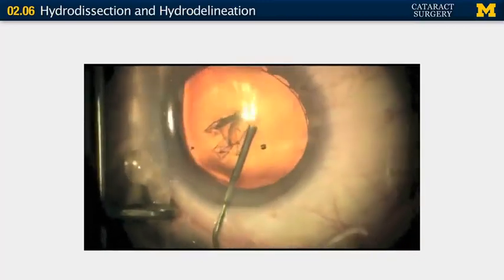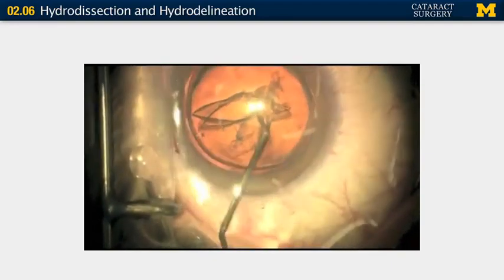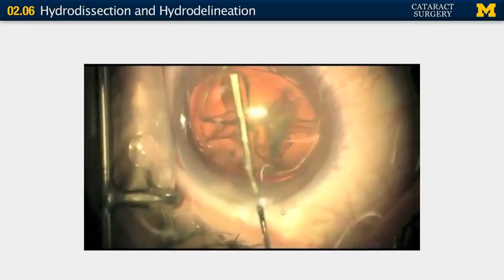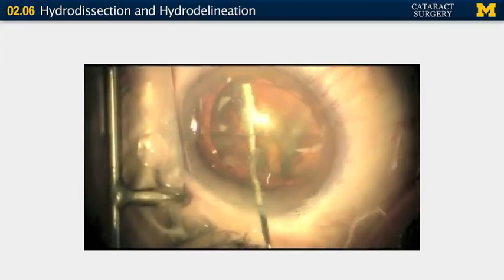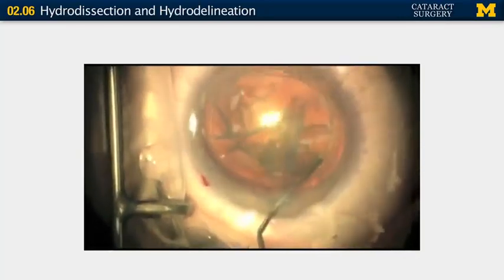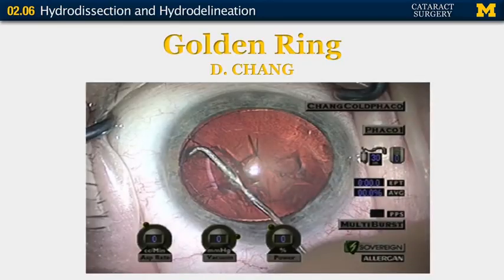Here you can see the cannula placed in the anterior chamber. This is a young patient with a soft nucleus, so instead of hydrodissection, hydrodelineation is performed, separating the nucleus from the capsule. In this case it's a nucleus that will not be cracked or chopped because it's too soft. You can see the edge of the hydrodelineated nucleus as a bright ring — this is called the golden ring phenomenon.